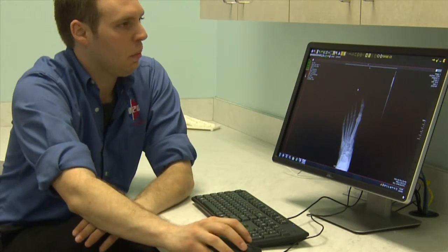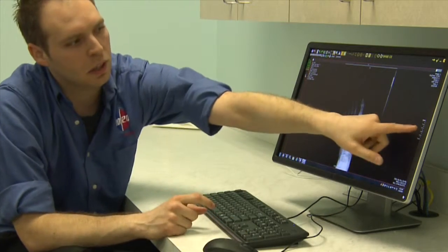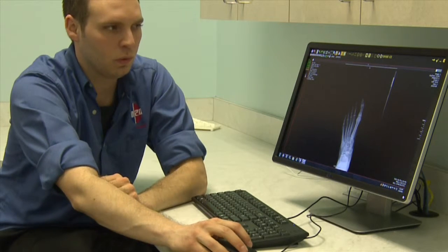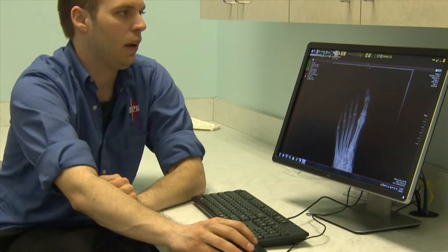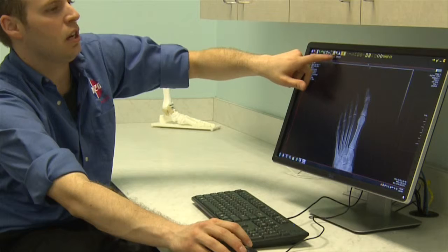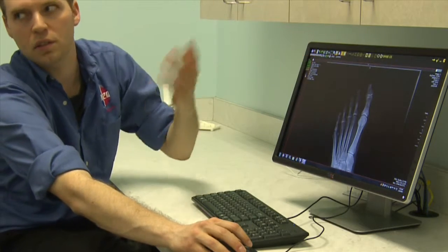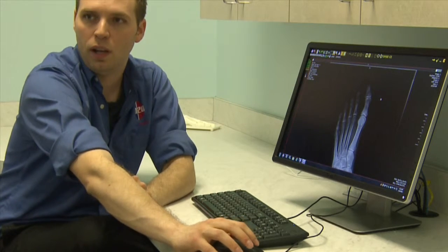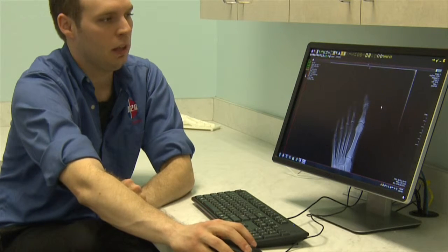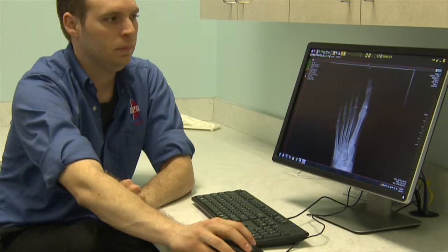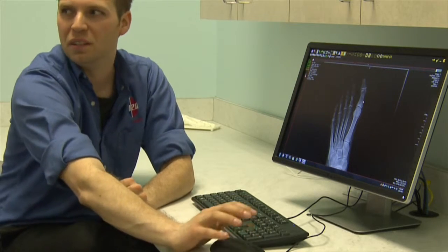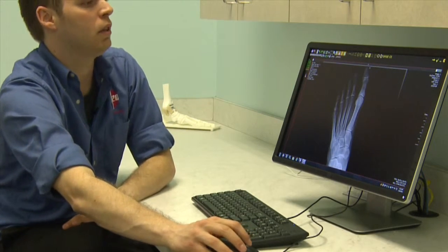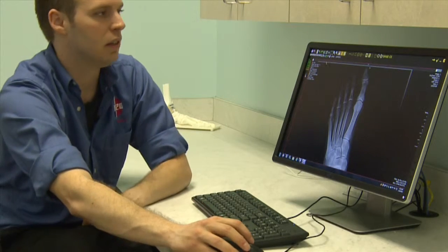There's a shortcut on the right-hand side — a graph or measurement bar. You can drag up and down on it to zoom in and out without selecting the zoom tool. As you do this, the active tool indicator at the top changes automatically to zoom. For panning, a shortcut is clicking both the left and right mouse buttons at the same time — it'll pan around. It's a little weird to get used to, but it works.